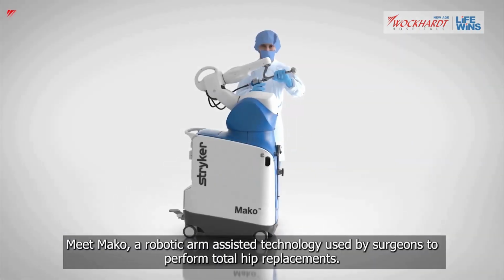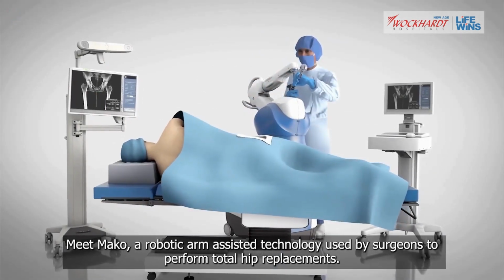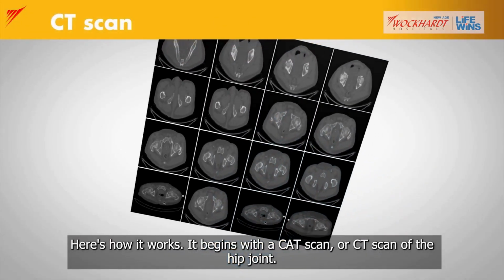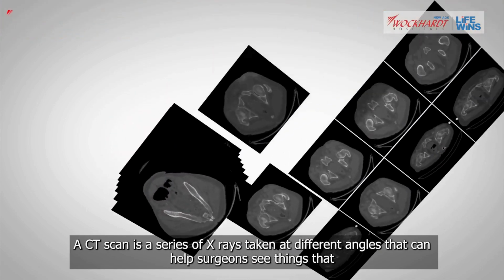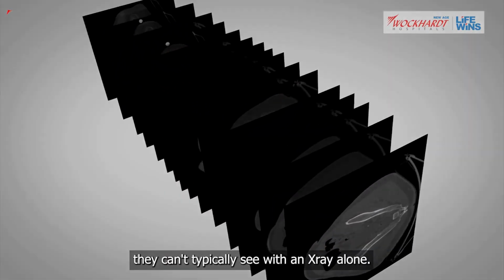Mako, a robotic arm-assisted technology used by surgeons to perform total hip replacements. Here's how it works. It begins with a CAT scan or CT scan of the hip joint. A CT scan is a series of X-rays taken at different angles that can help surgeons see things that they can't typically see with an X-ray alone.